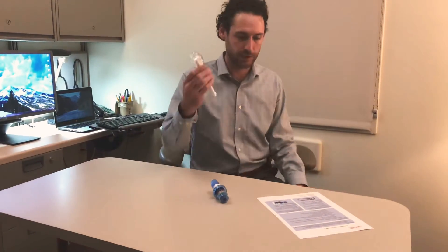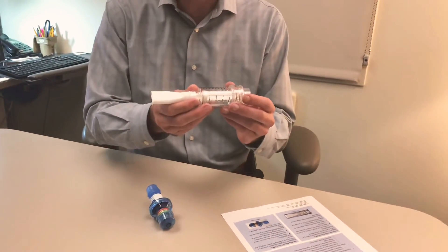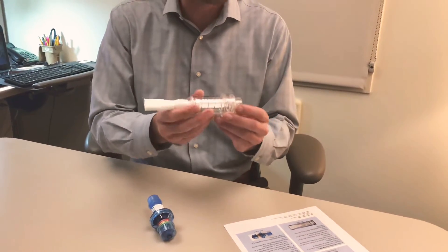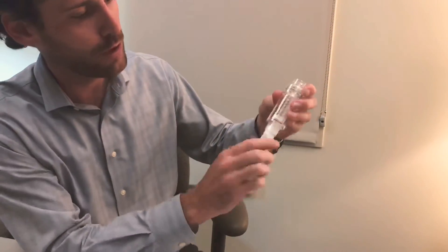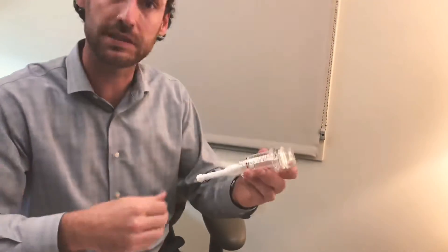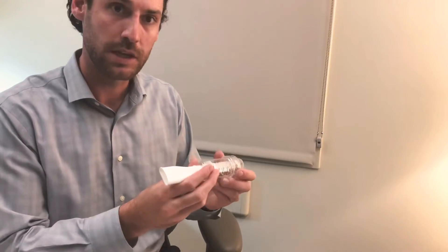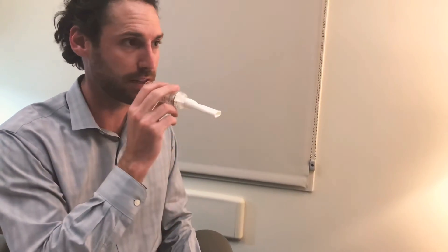The inspiratory muscle trainer is right here, and this is the one I typically give to my patients. It can actually double as an expiratory muscle strength trainer — you just flip it around. There's a spring here, and when you put more pressure on that spring it puts more pressure on the valve, creating more resistance. So on this device you take a breath in and breathe out to do inspiratory training. If you want to do expiratory training, you flip the device around and breathe out against it.